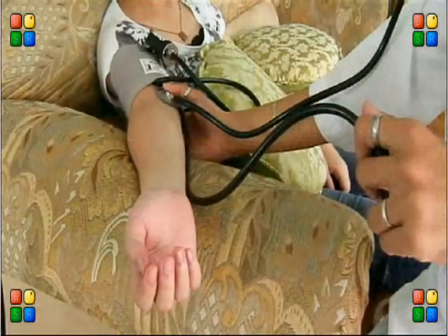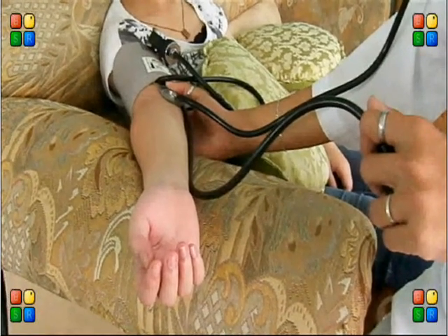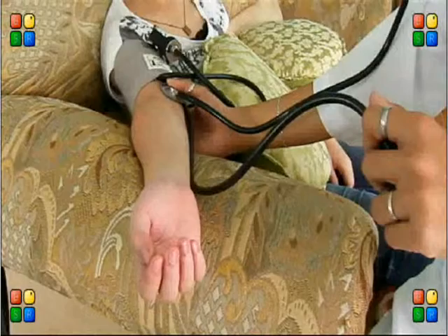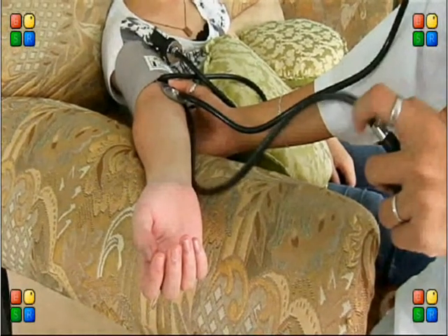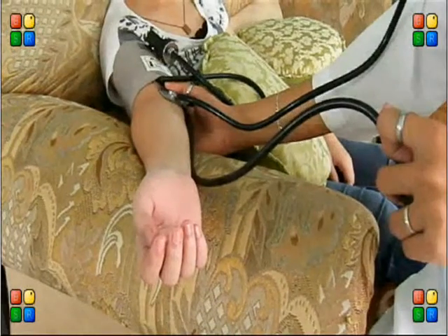Release air slowly. When the first beat of the heart is heard, record it as the systolic pressure. Take the reading again when the thumping of the heart disappears. This is recorded as the diastolic pressure.